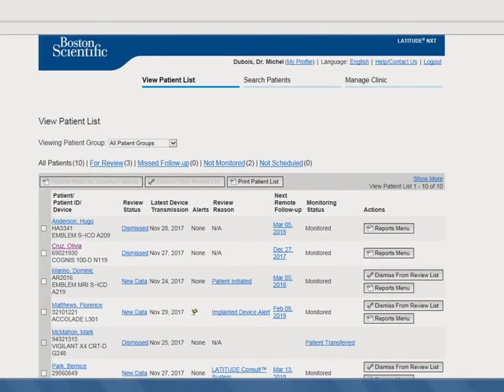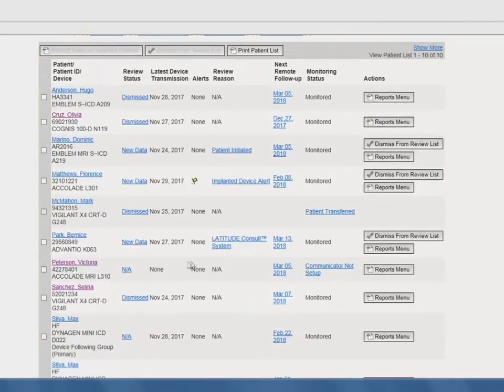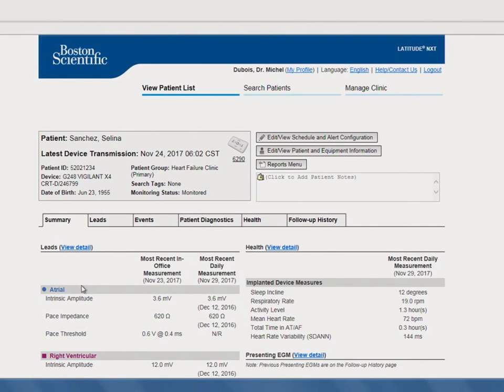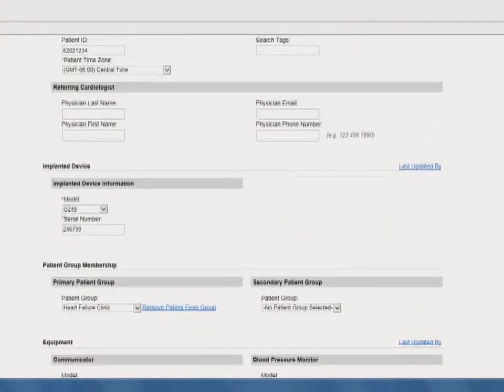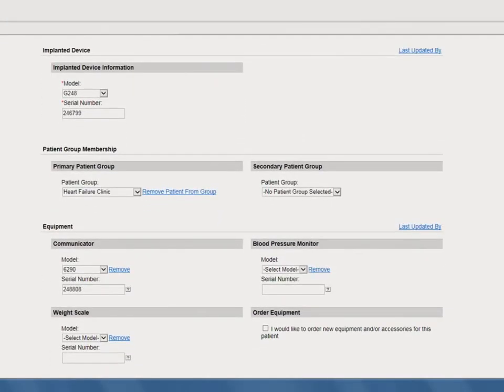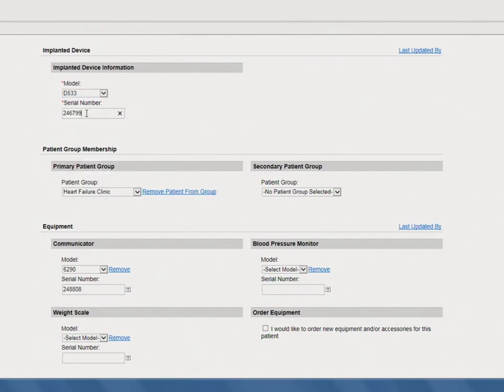After a patient has their device replaced, simply find the patient in Latitude Next and click on their name. Next, click on the Edit View Patient and Equipment Information button. Scroll down to the Implanted Device section and update the patient's implanted device model and serial number. Please note that updating the patient's implanted device information immediately removes access to the previous implanted device data, so it is important to print out any follow-up or alert history prior to saving the update.